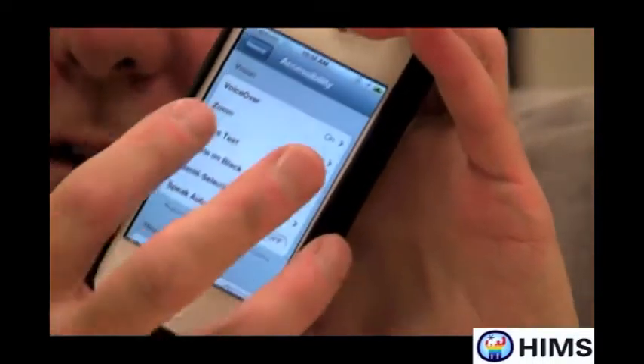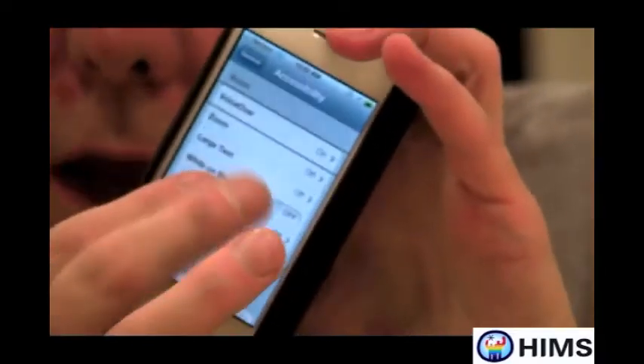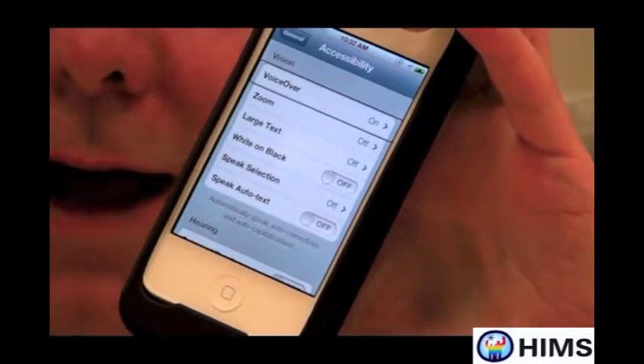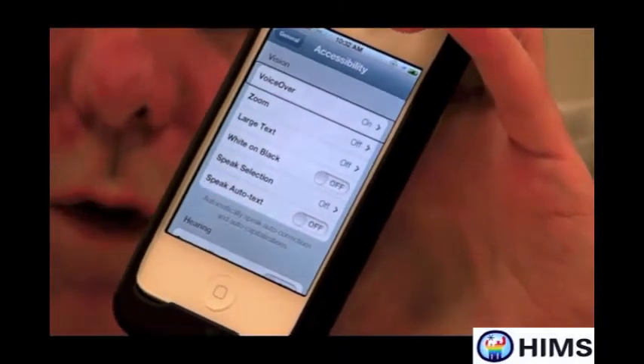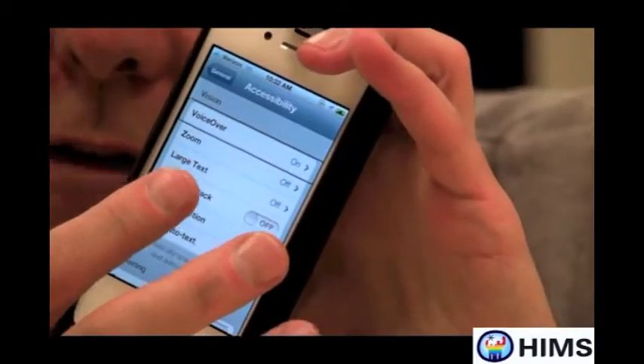One of the first items under Accessibility is VoiceOver, so I'm going to flick over to VoiceOver. VoiceOver is on. Now, VoiceOver is working. Since it's working, I can double tap on it and instead of turning it off, it will go into VoiceOver settings. So I'm going to double tap on VoiceOver.